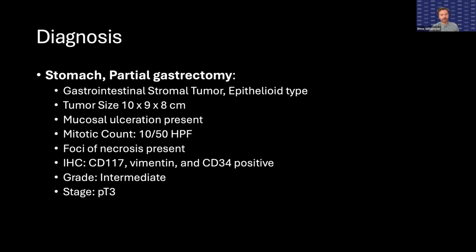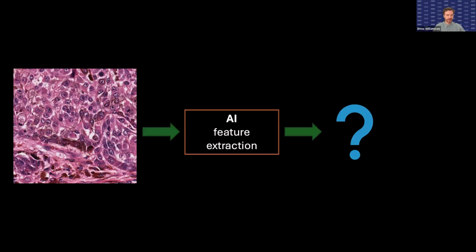And that's, I think, a totally valid way of extracting histologic features, and is certainly the way that's most important for patients today, even in 2024: you have a human, a natural neural network, interpret these images, extract some features, combine them into a final diagnosis, and that really drives the basis of all cancer care for every patient.